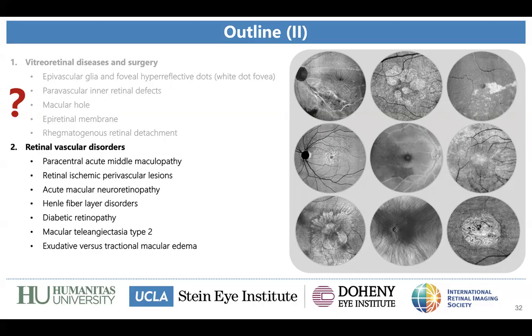Can I ask a question? Sure, Castillo. Alessandro, this is Gabriel Castillo, a friend from Brazil who is currently researching at the Cleveland Clinic, and he is a rising star here in Brazil. We have a lot of publications together, and he will teach us something today. Thank you, my friend. So, Alessandro, first off, congrats on your presentation. I know you're not done yet, but this is as impressive as your manuscript.